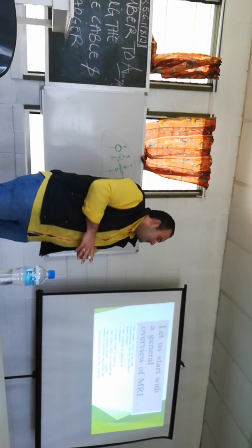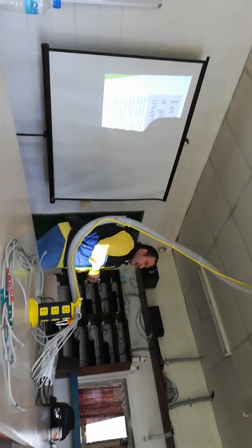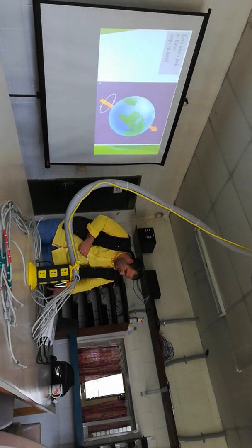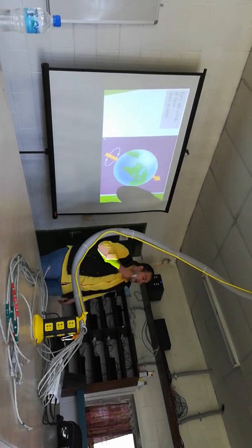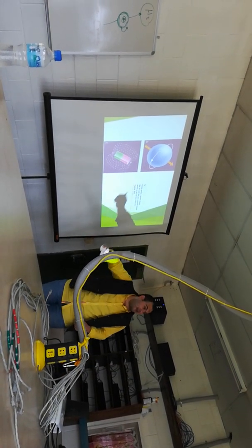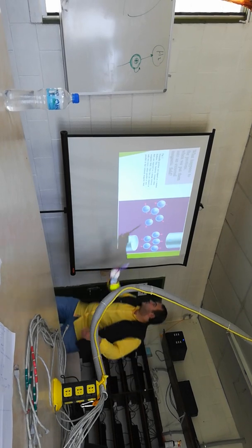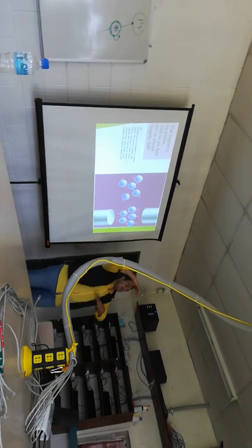Okay? It's clear? After that, I will put you inside the MRI machine. The proton is in motion like Earth. Like Earth, you'll find the Earth is moving around its axis, like protons. So the proton is a small magnet, okay, producing a magnetic field. Okay, so now the protons are in random motion, that's outside the magnetic field.